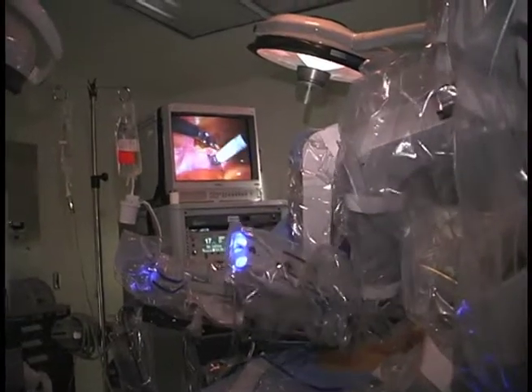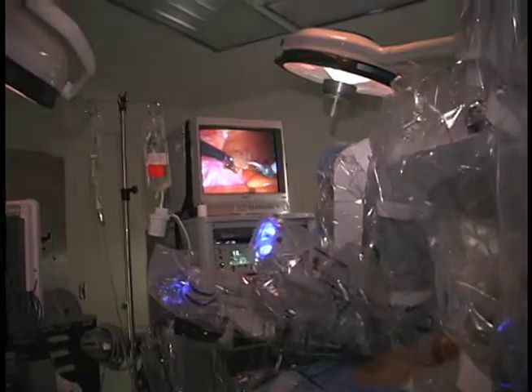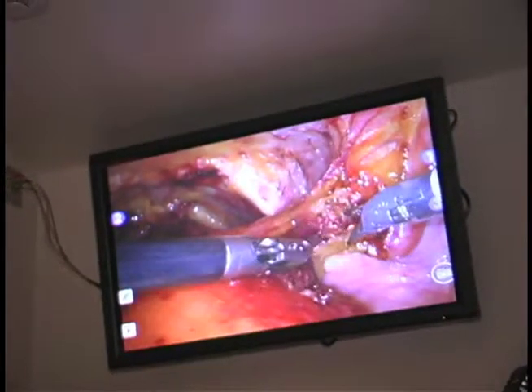It's much easier to suture. You can rotate — as you can see on the screen — you can rotate this instrument in all possible directions here.